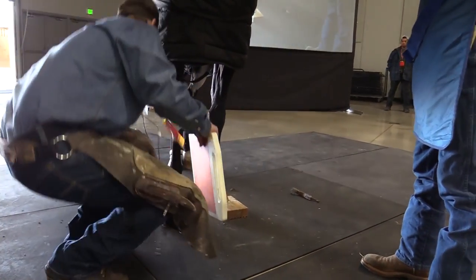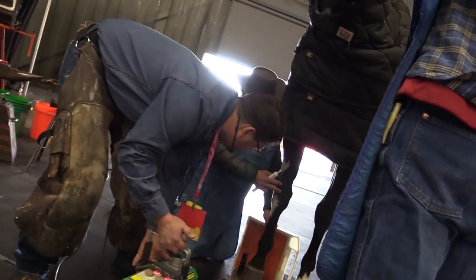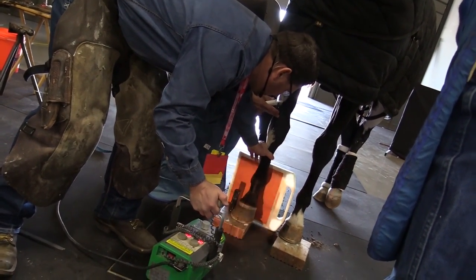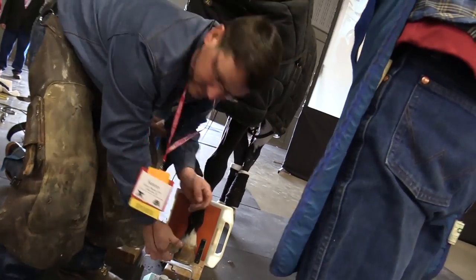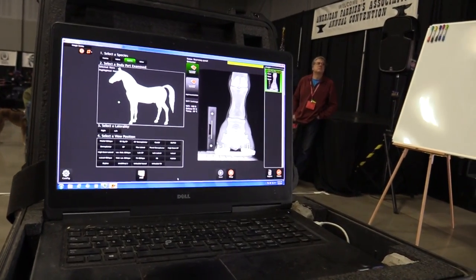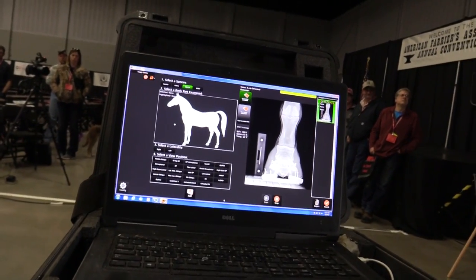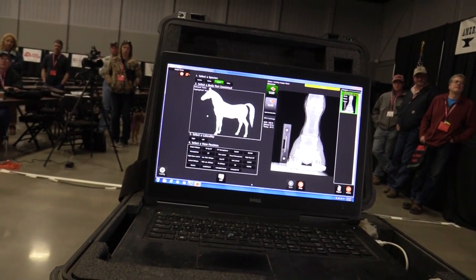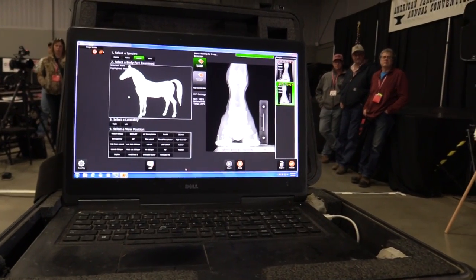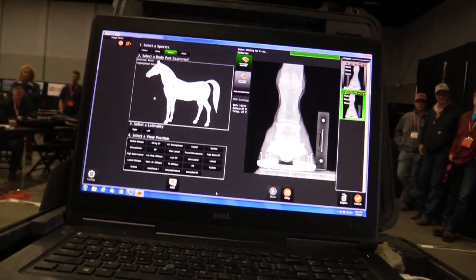See this stuff right here. Camera on the x-ray there, you can see it popping up. Rearming panel. Waiting for x-ray. Cool, buddy. X-ray detected. Image data. Rearming panel. Waiting for x-ray. Oh, buddy. This is probably a lot for him to think about. That's for sure.